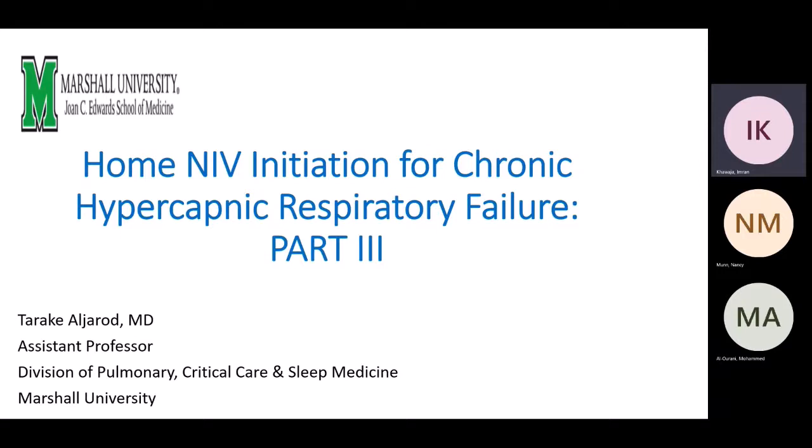And believe me, guys, it's more than BiPAP minimum and BiPAP maximum pressure support. Our understanding, what I noticed even at our own higher level, is very superficial about AVAPS when it comes to writing the prescription. And as pulmonologists, we should tailor the prescription toward the pathology being treated.